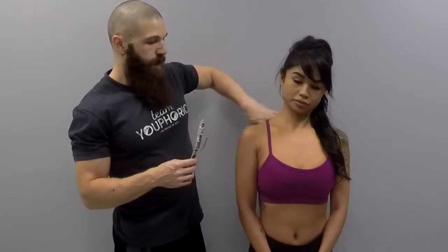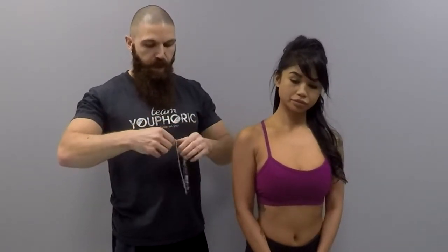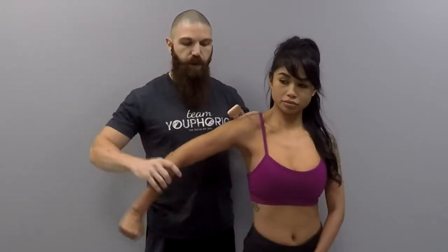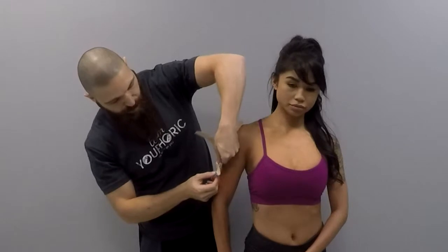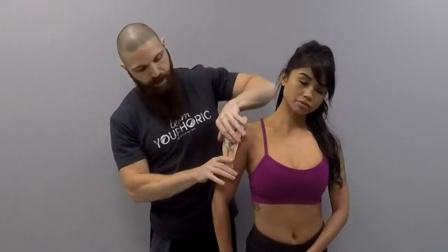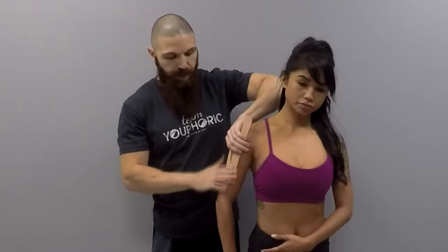With your Y-strip, you are going to apply the base at the deltoid tuberosity. If you don't know where the deltoid tuberosity is, you can have the client flex their arms and go into adduction — wherever the deltoid ends, that's where you are going to apply the base. With zero tension at all, you're going to rub to activate the adhesive.